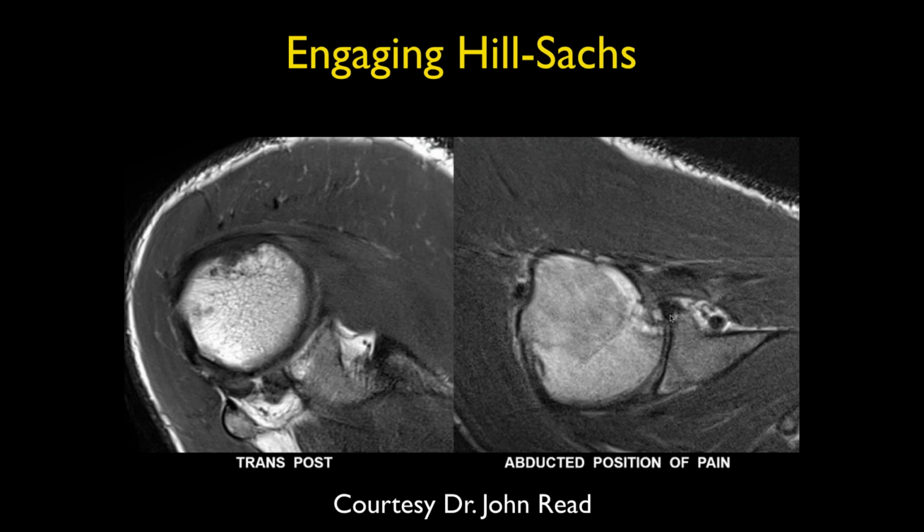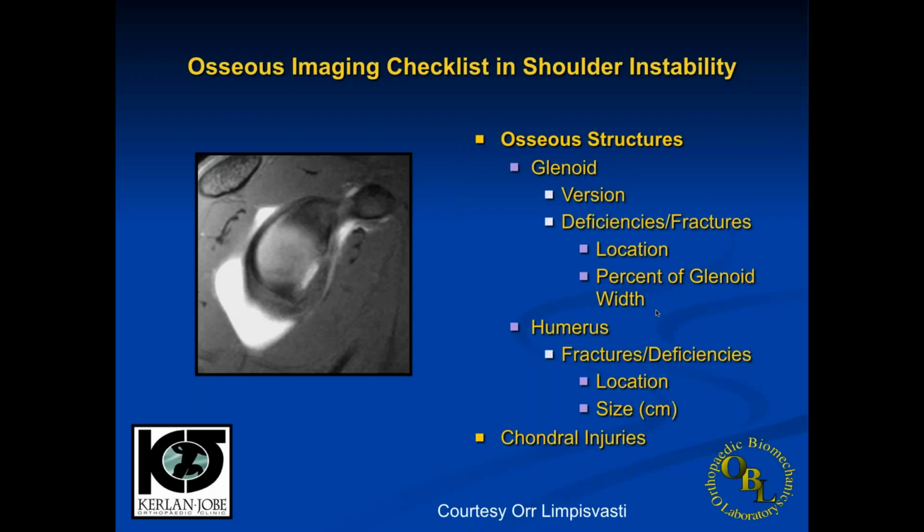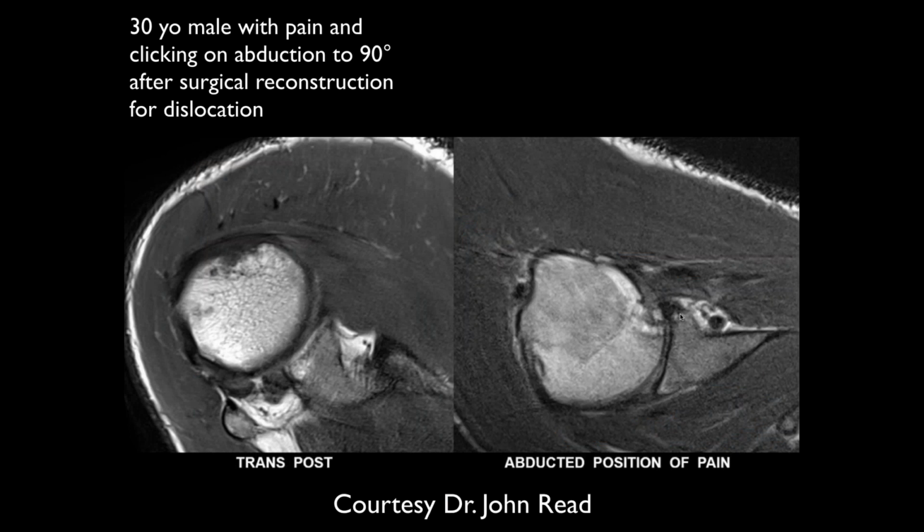Yes, they flipped him over. They flipped the patient over and put his arm up. So this is anterior and that's posterior. They bring the infraspinatus and pin it down, or you said the capsule. They bring the capsule and tack it down, called a remplissage procedure. I think we'll talk more about that later. So when we say engaging, we're engaging onto the glenoid. Anterior glenoid. The glenoid is falling into... I'm sorry, into the posterior. Right, posterior glenoid, right.